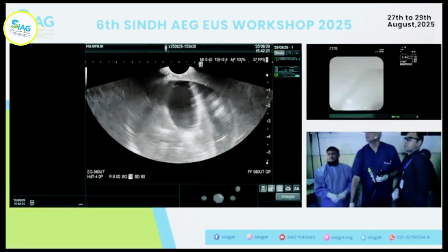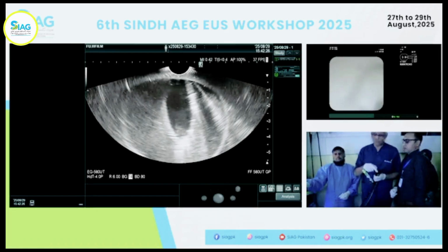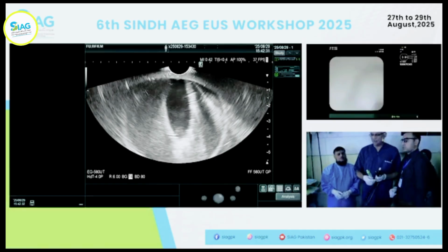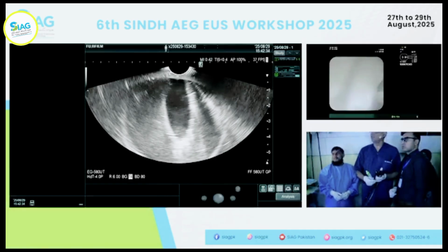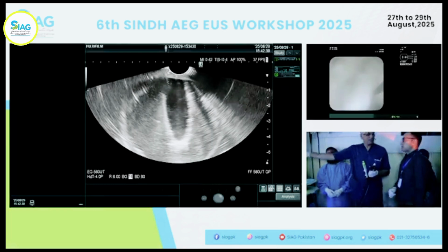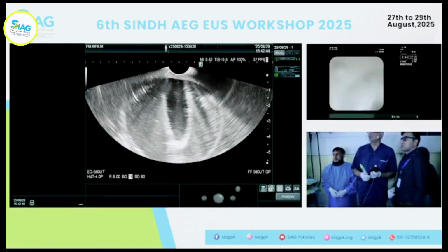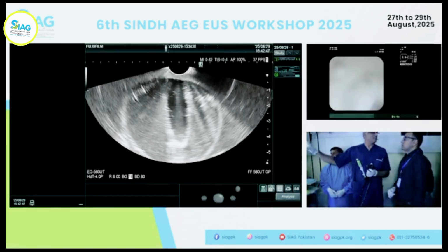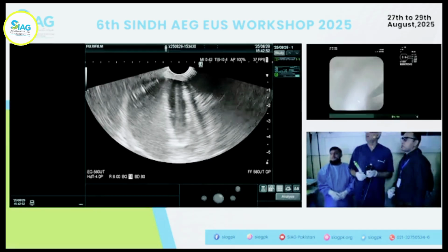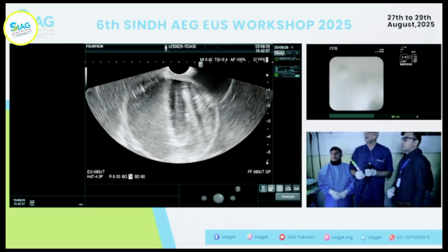So you see that what I've done is I've actually just lifted my big wheel. So you can lock it here if you want to. And now you want to see the sheath coming out, right? So you undo the sheath and elevator is out, and you can see the sheath endoscopically, yes, right? And because I think of the fact that we can't control the air here, I think you don't see it that well, but you can see it now. As you pull back, maybe you can appreciate something coming out, but you can see it on endo.